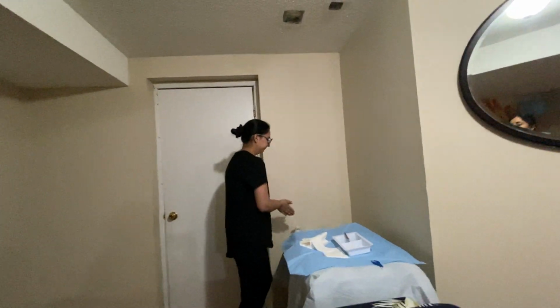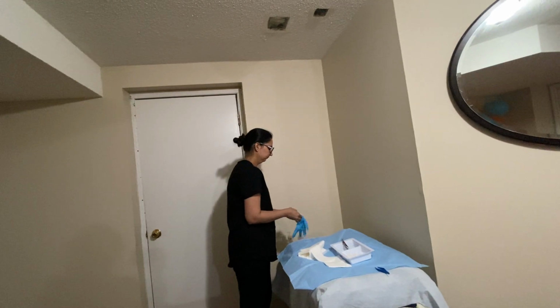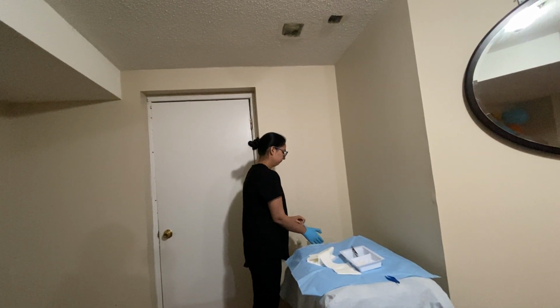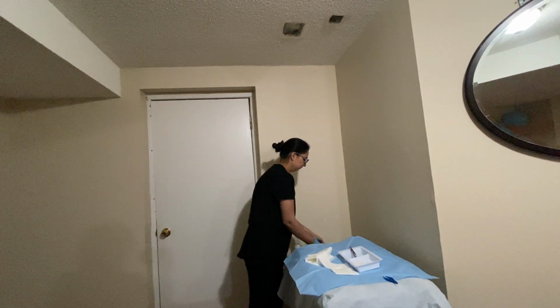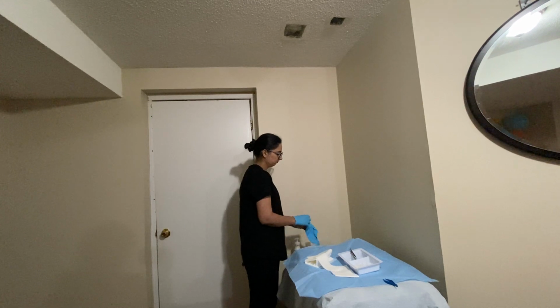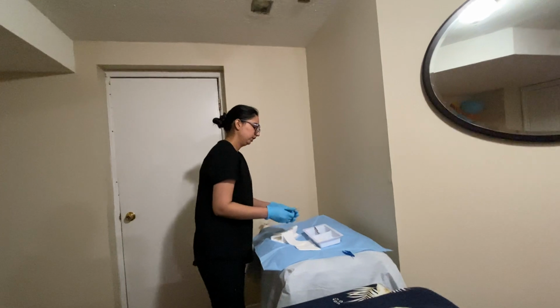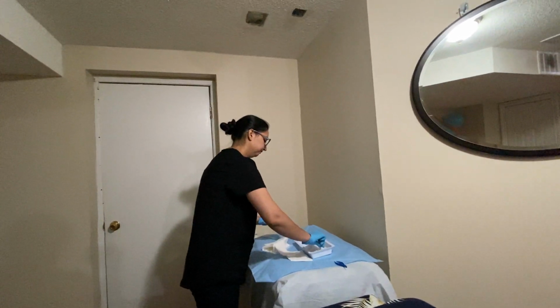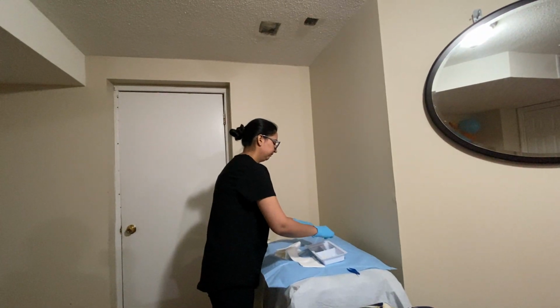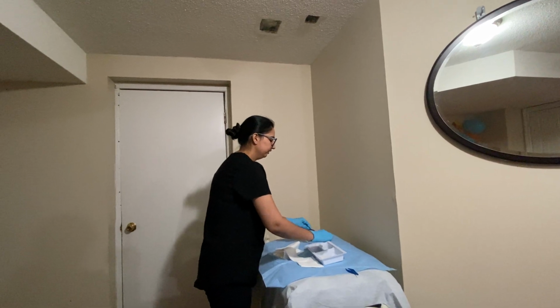Hand washing. Putting on another pair of gloves. Now taking one piece of gauze. Squeezing it.